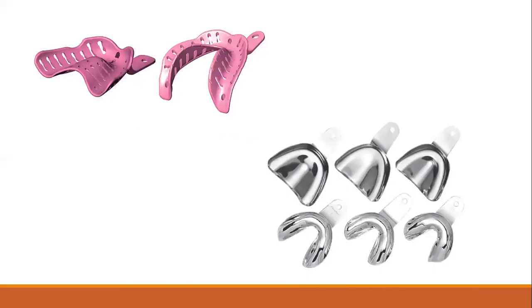So these are my stock trays. This tray is the tool that will carry the impression material, and we apply it to the patient's mouth. This is the lower stock tray and this is the upper stock tray. For a completely edentulous patient, the cross section of the stock tray is rounded, as you can see here. This is the cross section of the tray.